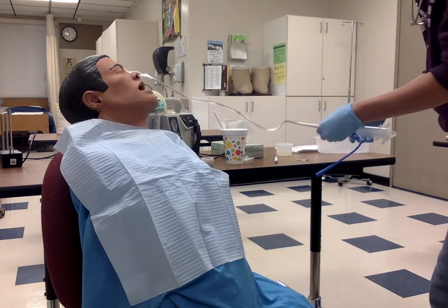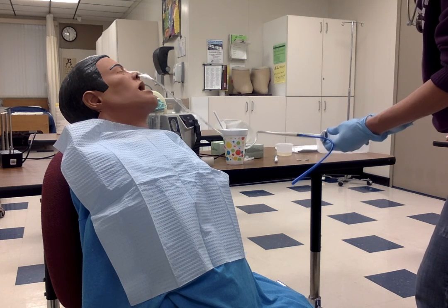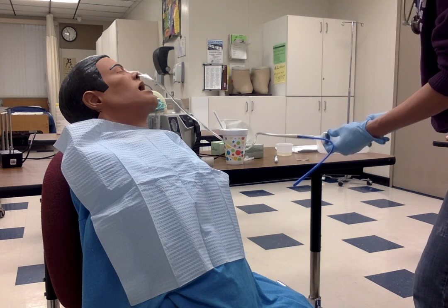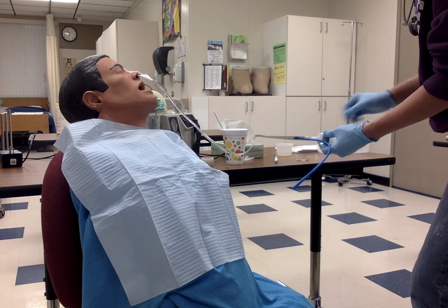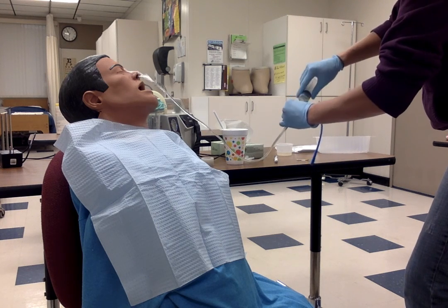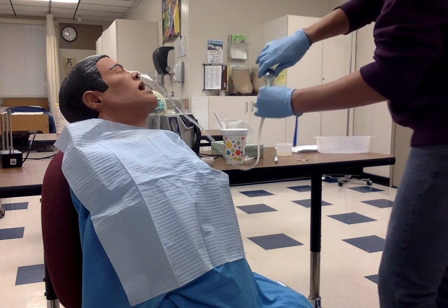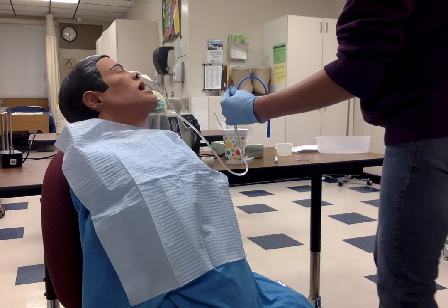So now at this point, you would probably have some secretions coming out of here. Okay, so we want to test the pH. So I'm going to go ahead and aspirate back. And sure enough, I'm getting some right away. So I'm going to go ahead. And now secretions could come out here, so you want to be kind of careful. And I'm going to go ahead and put this in.